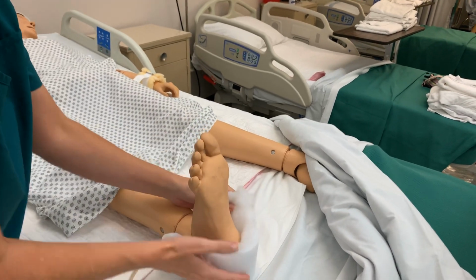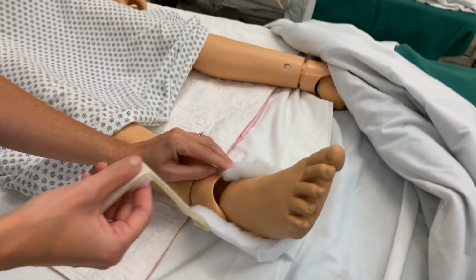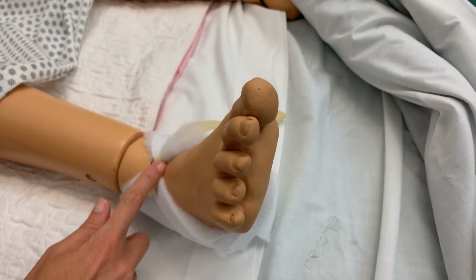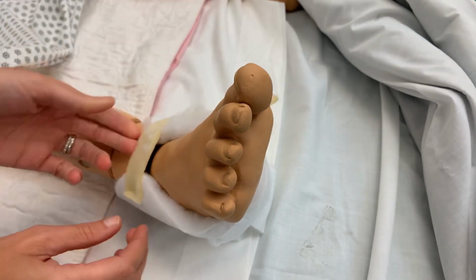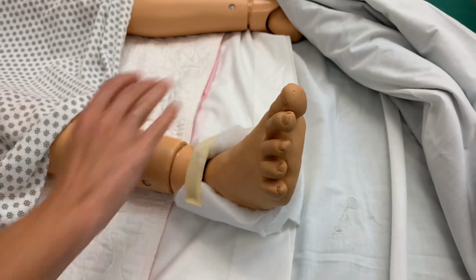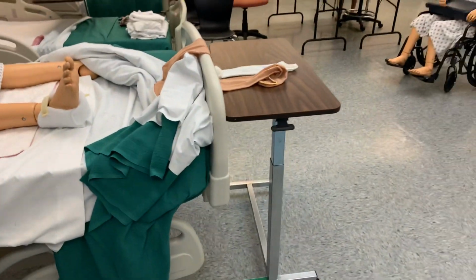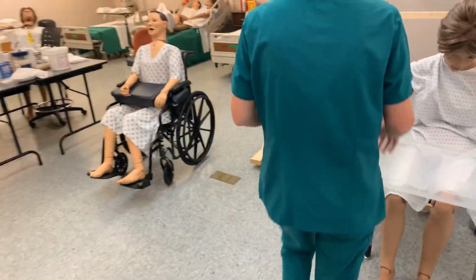So this is placed on their heel, but then look here. This strap does not need to be cinched so tight. Look, if I can't fit my finger under there, you could actually cause breakdown with that device. So you always want to make sure you have it, but see, I can fit my fingers underneath there. So just wanted to show you that because you may see that at a facility as well. Now I'm going to come to my box of protective devices, and I'll come back to this area so you can see what else I have here.